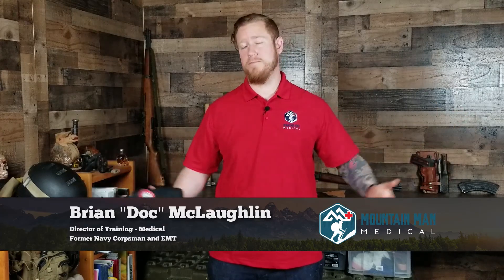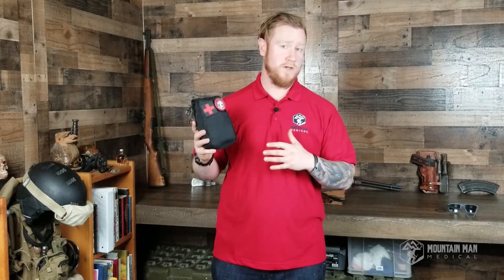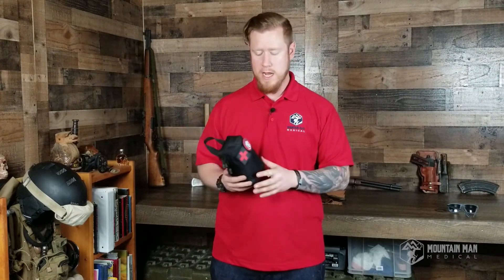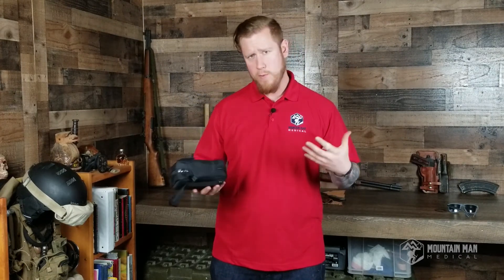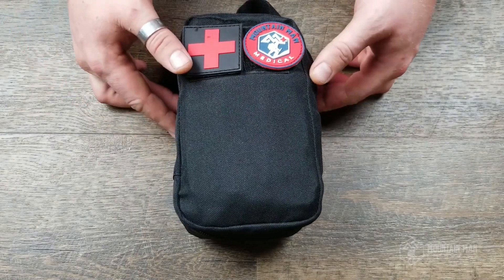What's going on guys, welcome to the Mountain Man Medical YouTube channel. My name is Brian and today I thought we would talk about the contents of our medical kits. This is the Yellowstone kit — it is the larger of our two kits and our best-selling one. Today I thought we would go over what's inside, what they're used for, and why I chose these particular items.